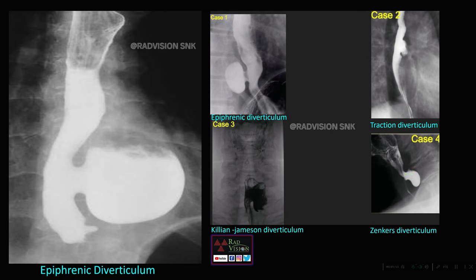To summarize the four diverticula: epiphrenic diverticulum is just above the diaphragm in the lower esophagus; traction diverticulum is in the middle esophagus; Killian-Jamieson diverticulum is on the anterior and anterolateral aspect in the upper esophagus just below the cricopharyngeus muscle; and Zenker's diverticulum is at the level of the cricopharyngeus muscle, also in the upper esophagus.